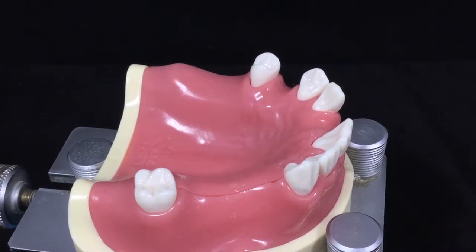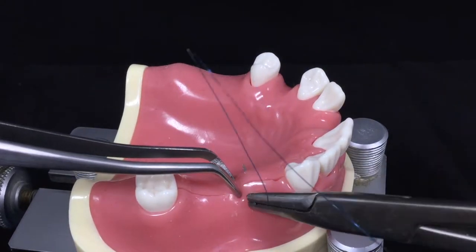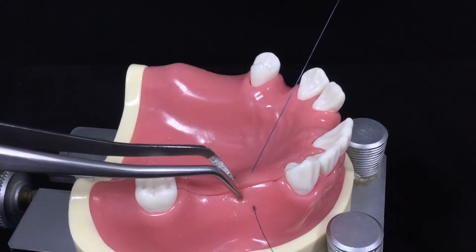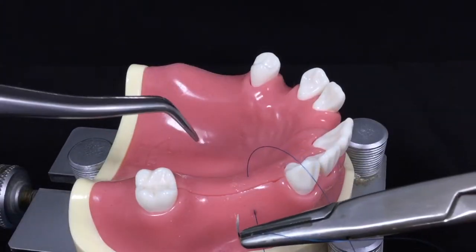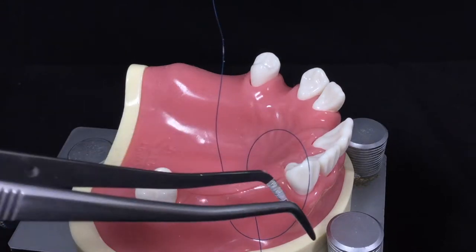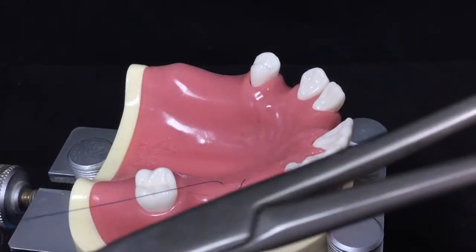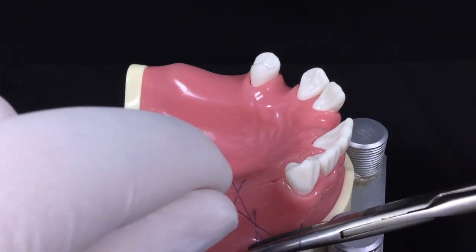This is the crossed matrix suture, or X suture. You enter from the buccal flap, come out on the lingual flap, and separate it. You then enter from the buccal again and come out on the lingual flap once more. This creates the X mark on top of the incision line.